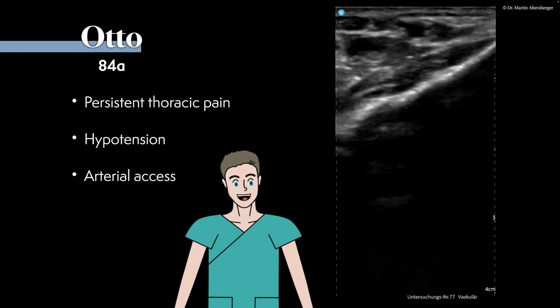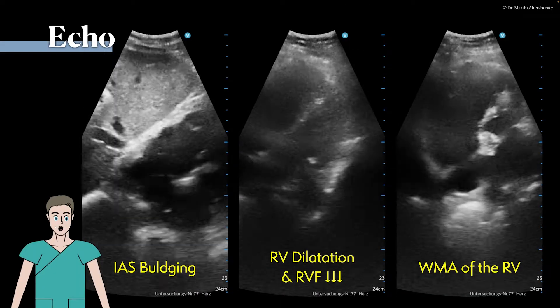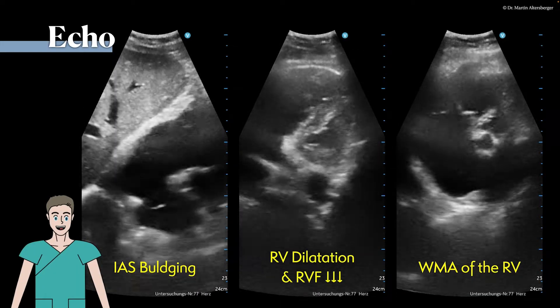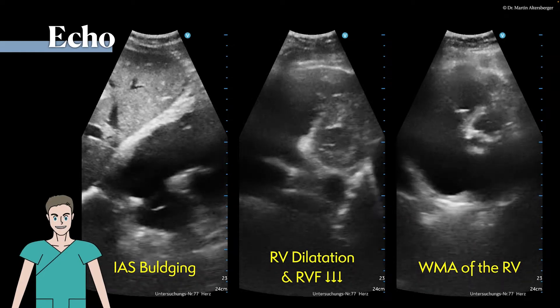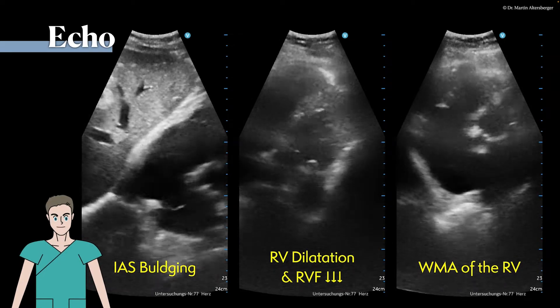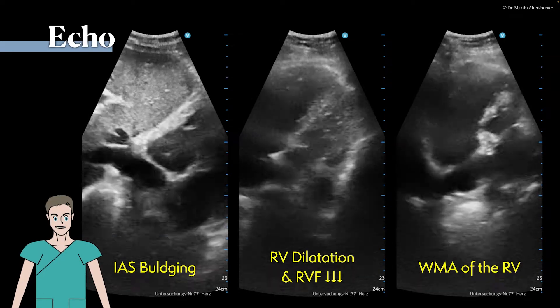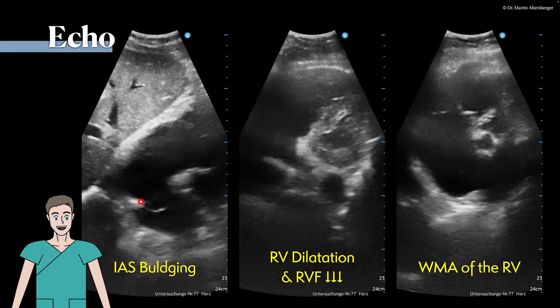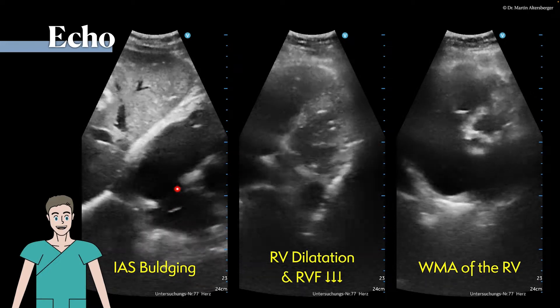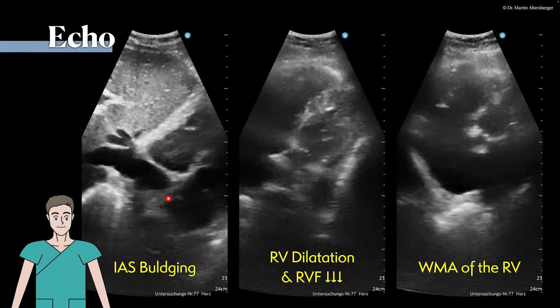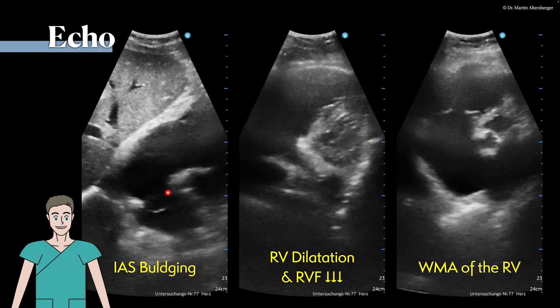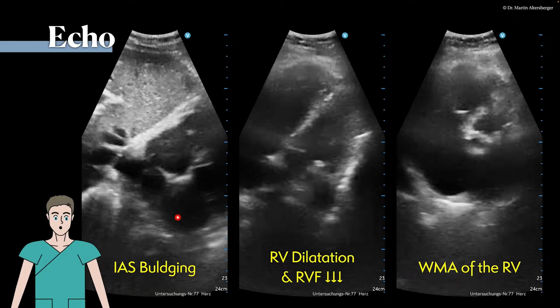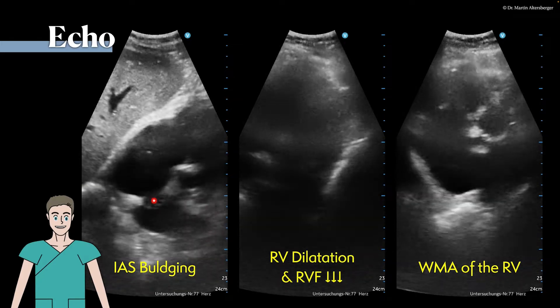Why is Otto feeling bad? We performed a point-of-care ultrasound, and in this echocardiographic exam we can see that in these subcostal images we have an interatrial septum which is bulging from the right side towards the left side.